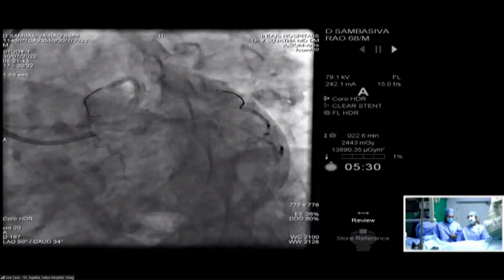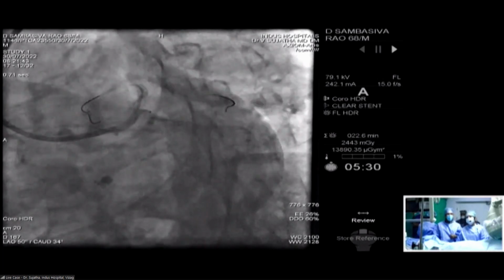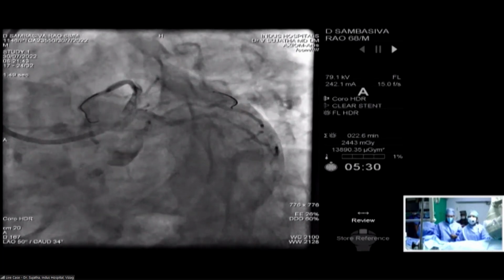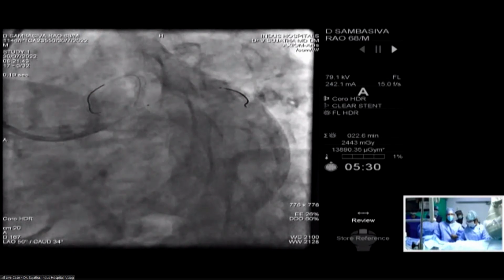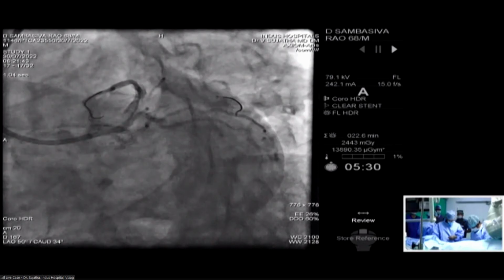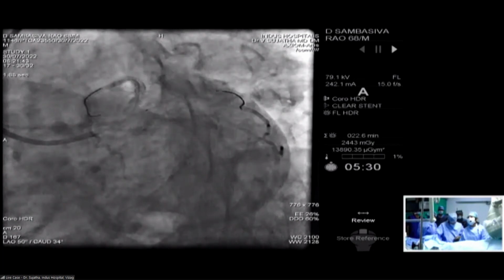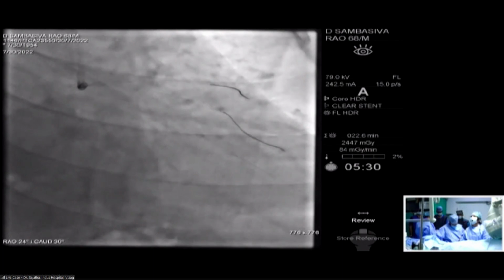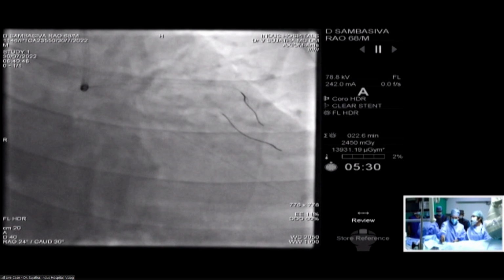Right. After stenting, after taking care of the LAD, because the patient is having pain, I want to do the left main to the LAD first before I think about the OM3. Though I can easily use a drug balloon in the OM3, only the cost considerations are making me think. Yeah, that's the only reason. That would be for me, stent. Actually, I was talking to the company to evolve a package where if it is 2 or 3 balloons per patient, you charge per patient, because otherwise it's quite challenging to open many balloons if they have multiple lesions. I think we need to talk to them further.